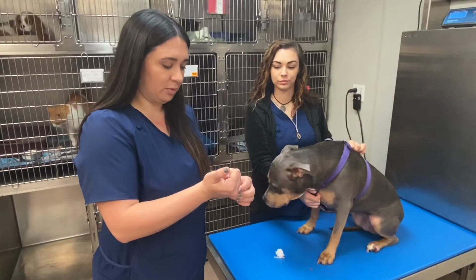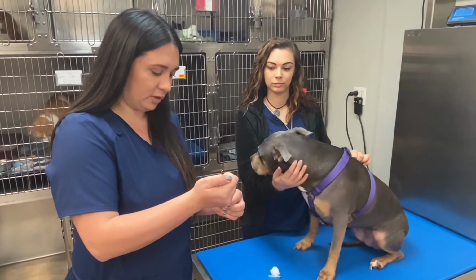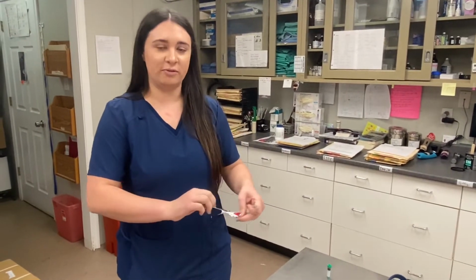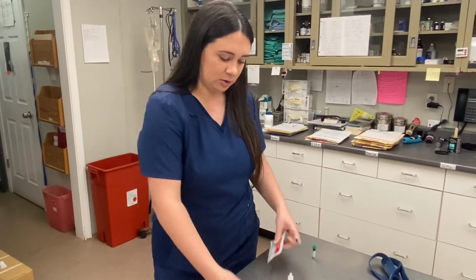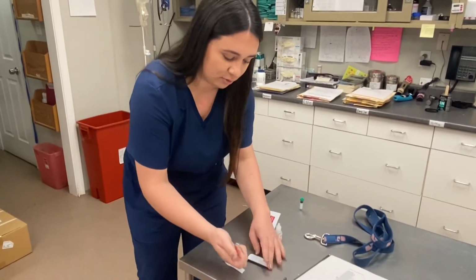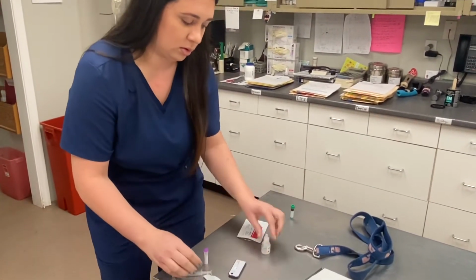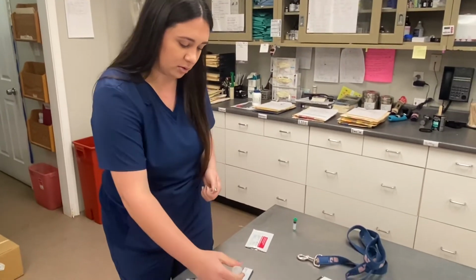We're going to take our sample and put it in a green top tube for the chemistry profile. We're going to be running a heartworm test, a test for the antigens of adult female heartworms. You're going to take your test, and you put your sample directly in the well. Then you're going to have 2 drops of buffer.